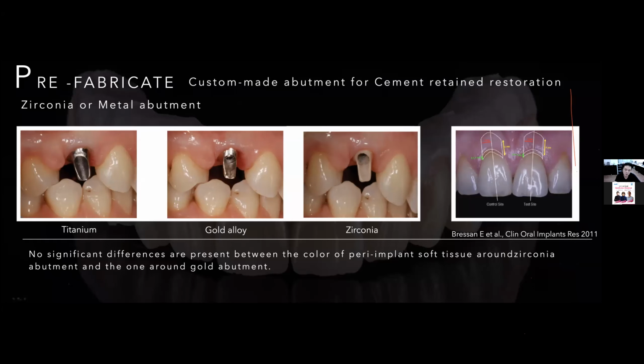So when we set the abutment into the patient's mouth, into the tissue, the tissue view is always not the same as the neutral abutment. If you have a very thick tissue type, I think everything is easier to create. But for Asian patients, the tissue is more the thin type. So for an Asian technician who wants to create a cosmetic abutment, you must think and think first, and then design it very carefully.